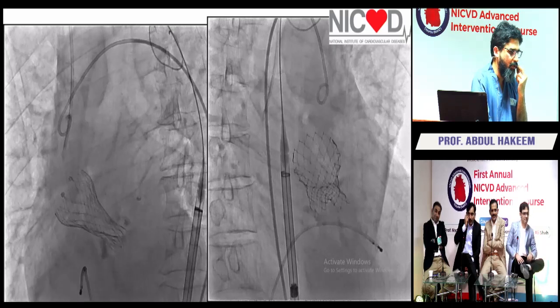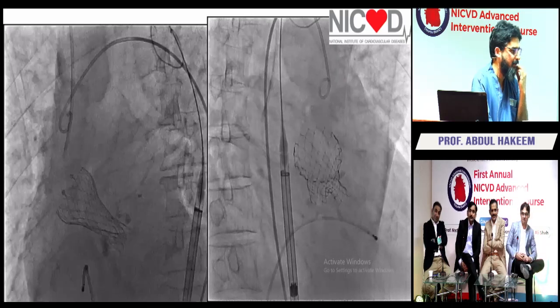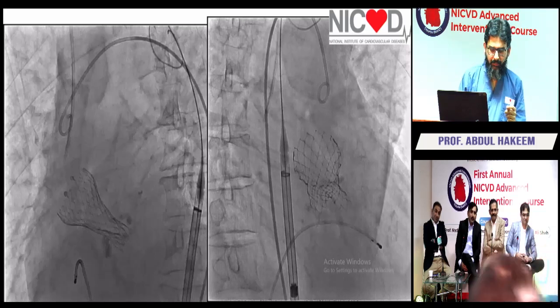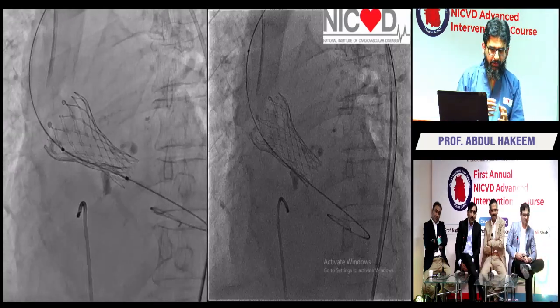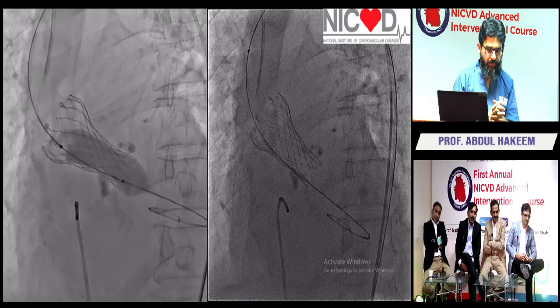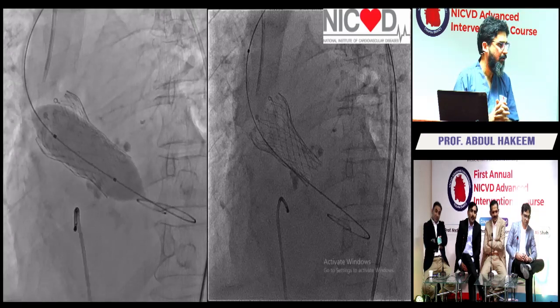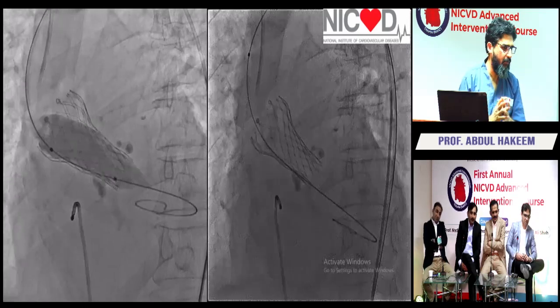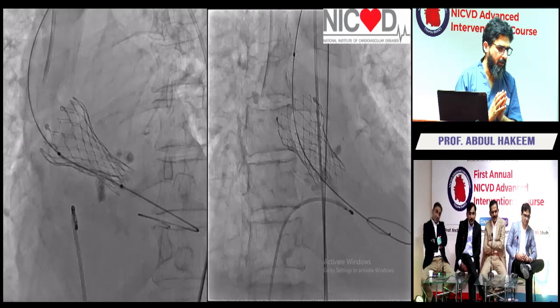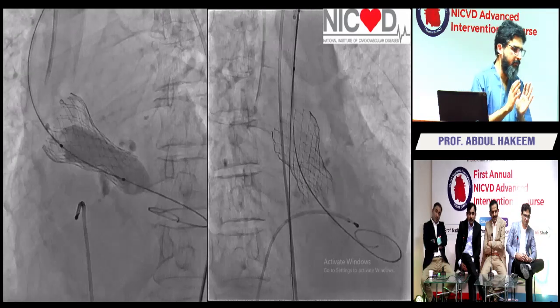But what was reassuring was we knew there was so much calcium that was really going to hold on to this. So then we took the same size balloon again, and I just want you to observe how the enfolding was gotten rid of. And this should not have happened. Just pay attention. And this is why valves embolize.